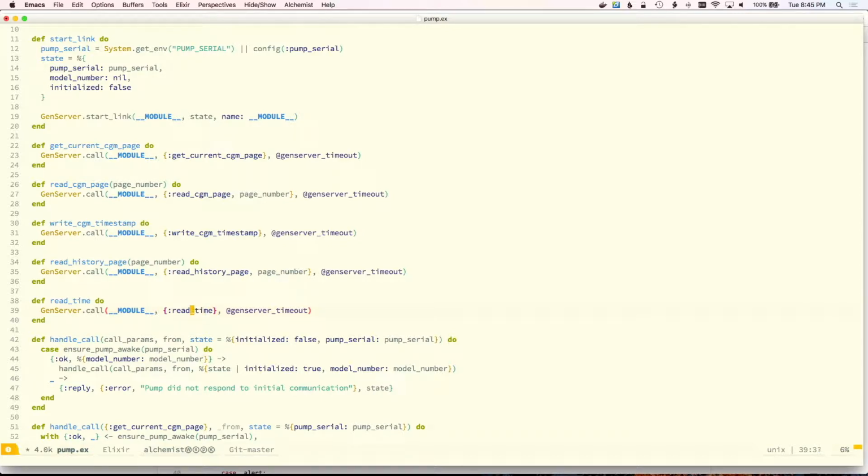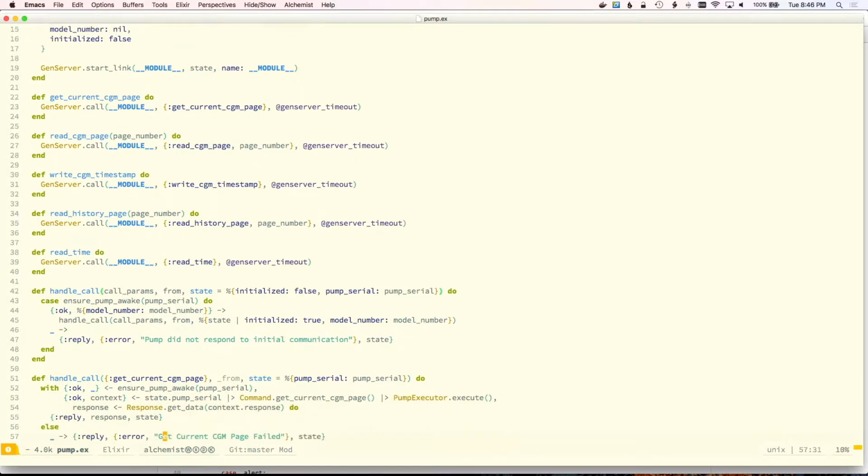I don't know the convention here. When you have a single thing like this, is it still convention to put it inside a tuple even though there's no parameters like that? I've been running into some dissonance here with some of these things taking parameters and other ones not. I could just as easily pattern match without it, and I'm not sure what the going decision is in the community for that. So if you want to put that in the chat, that would be really helpful for me to make a decision about that.